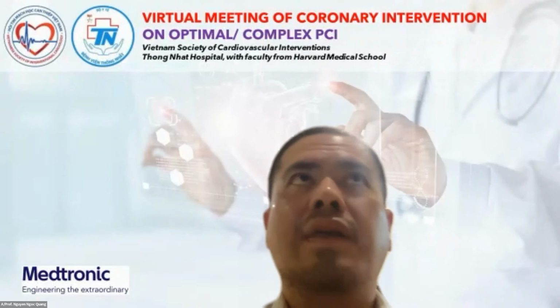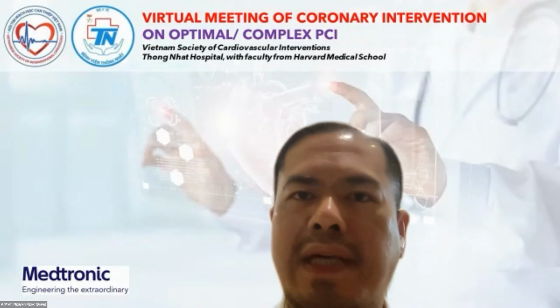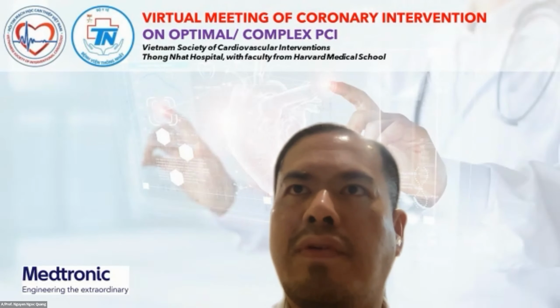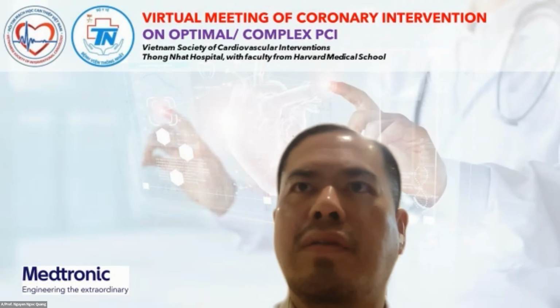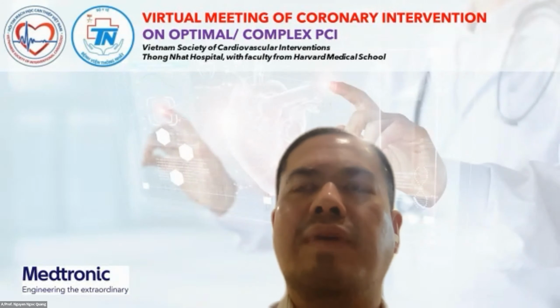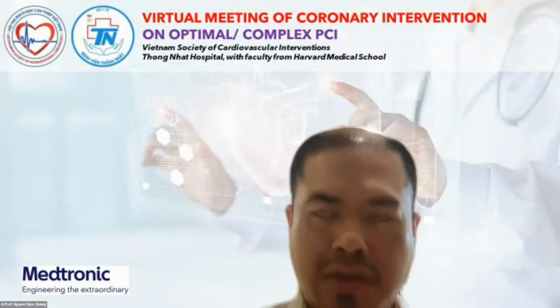I think I totally agree with Dr. Pinto's point about the first time when we do the PCI, we need to optimize everything first to avoid potential future complications. Because sometimes after you put in a stent, there is nothing you can do, even with a lot of devices. And I want to ask Dr. Pinto about one thing.